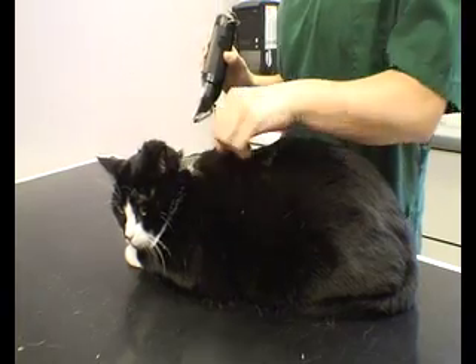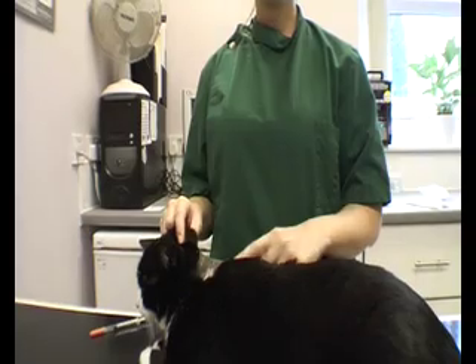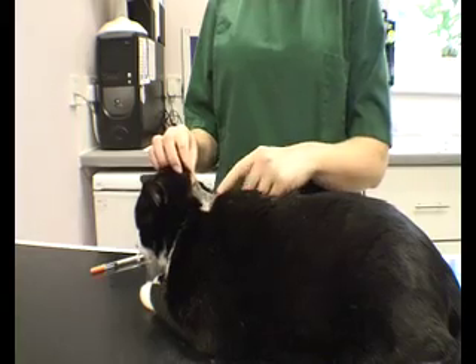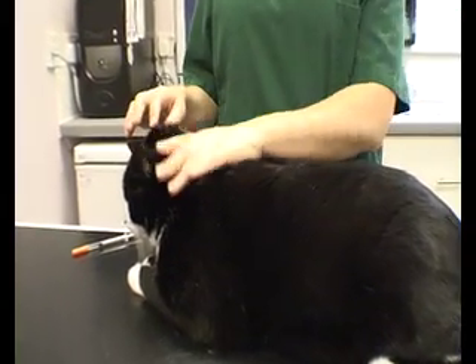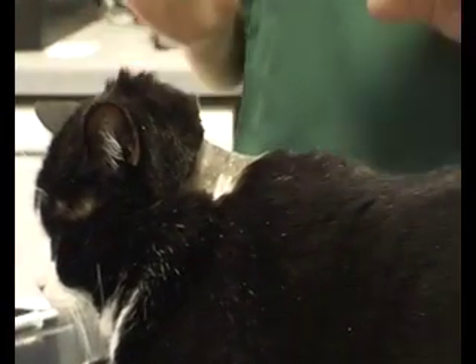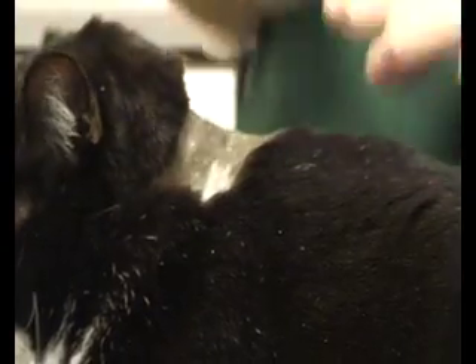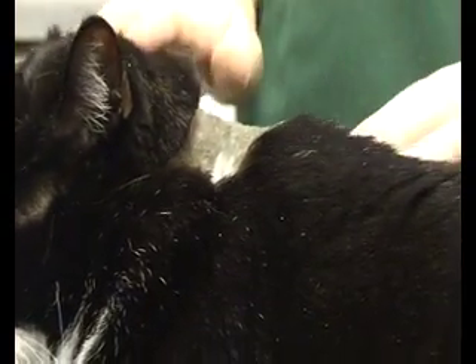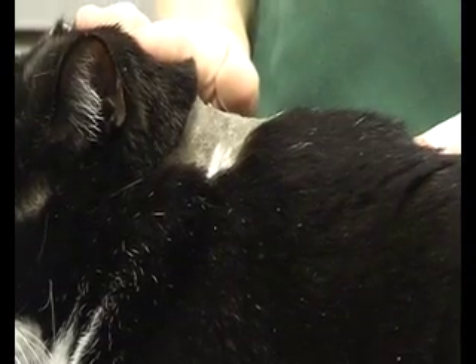What I do with all my diabetic cats is I shave a patch of hair on the back of their neck. Injecting into the scruff at the back of the neck is the easiest place to inject in a cat, and if you take off the hair first it's much easier to see the skin and what you're doing. They don't have to have a clipped neck all the time — when you're learning it's easier, but once you get good at it you can let the hair grow back and you'll have no problems at all.